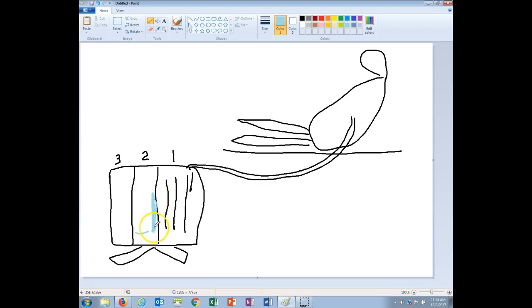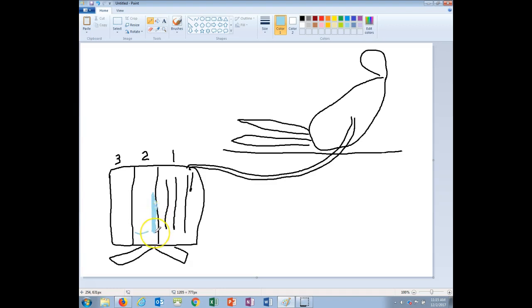Tidling is good and that's going to happen when a person breathes. When they breathe in, fluid's going to go up, or if there's a spontaneous respiration it will rise, and that's basically because it's increasing negative pressure within the lung. So you'll see the rise and fall there. That is called tidling in the water seal chamber. That's absolutely fine.